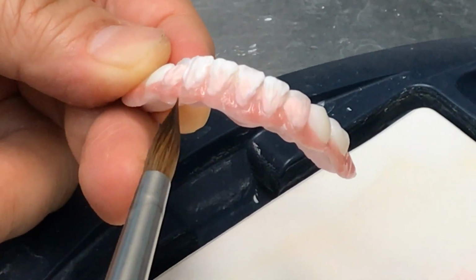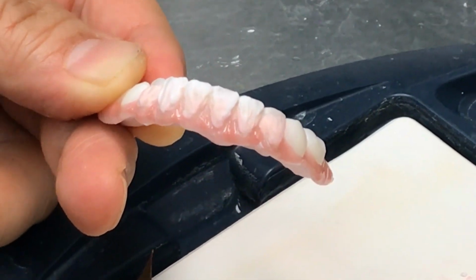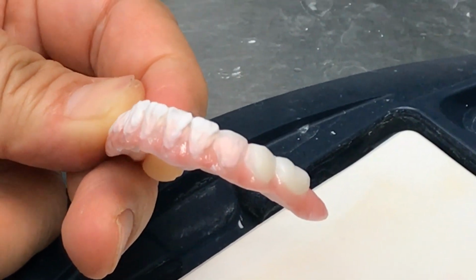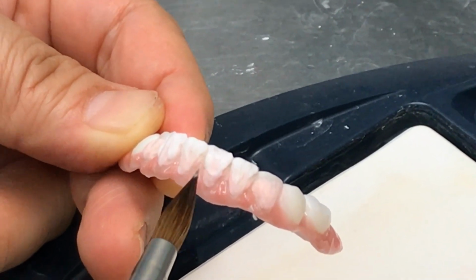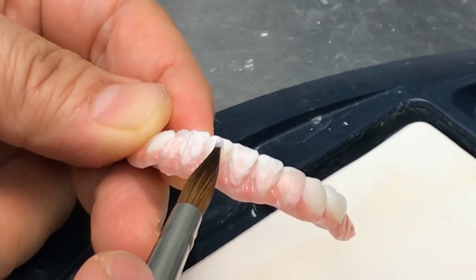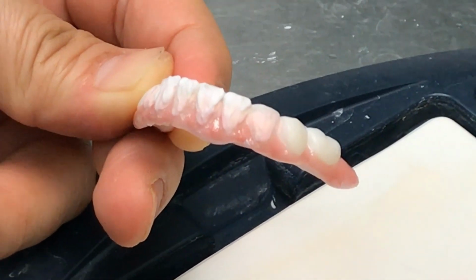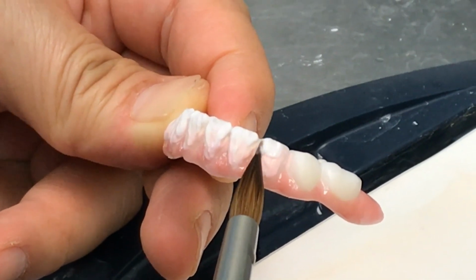So here's the basic background. I put the gum colors first to bake. Okay, here's the mono, so I don't have to do anything. There's a 4 unit. Create natural as possible. And now here's a canine, just a little bit.